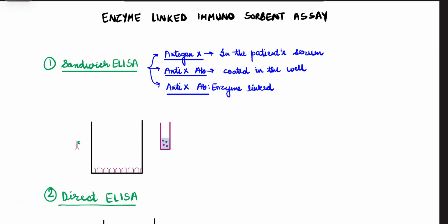Hello dear learners, in today's class we are going to learn about a technique which is referred to as ELISA, or in full form, enzyme linked immunosorbent assay.